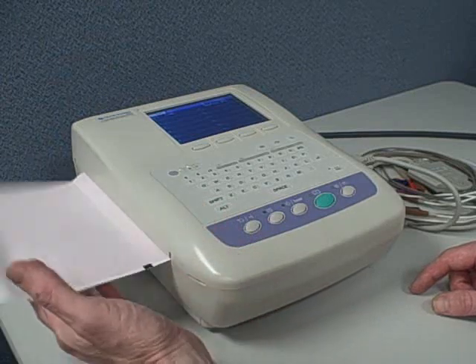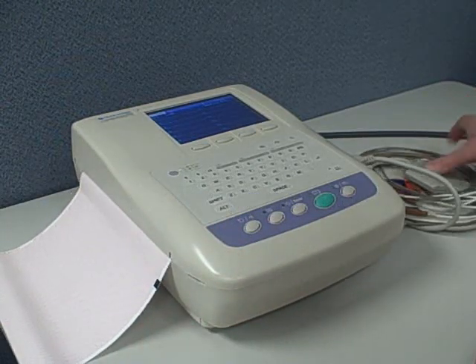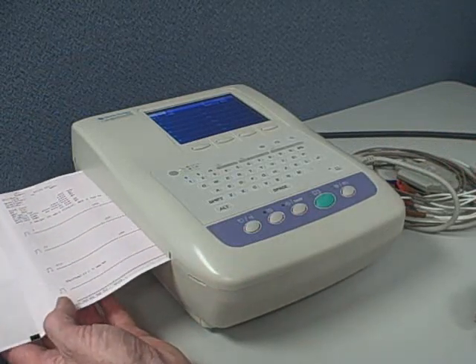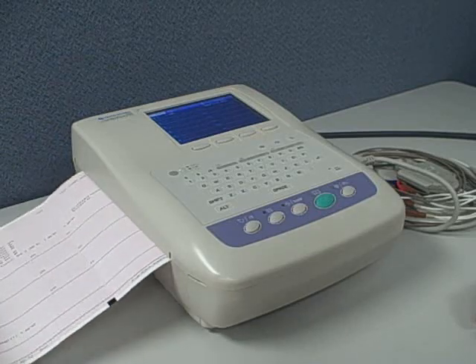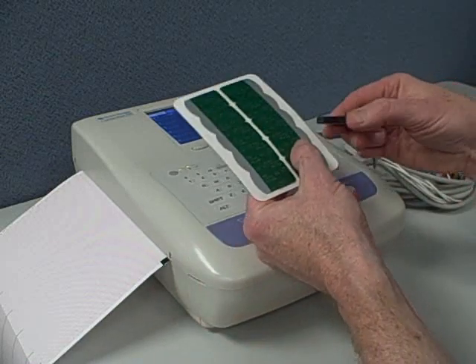The paper comes in a perforated Z-fold pack, loads easily into the paper canister, and prints out at the touch of a button. Here's a look at the full-page printout with EKG and demographic and interpretation info on the top.